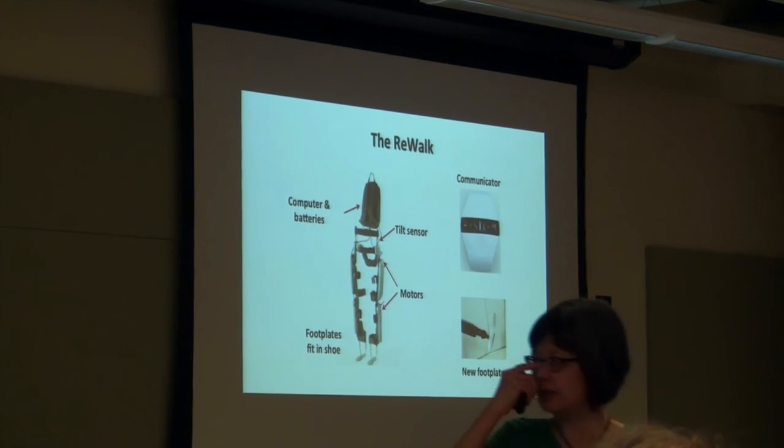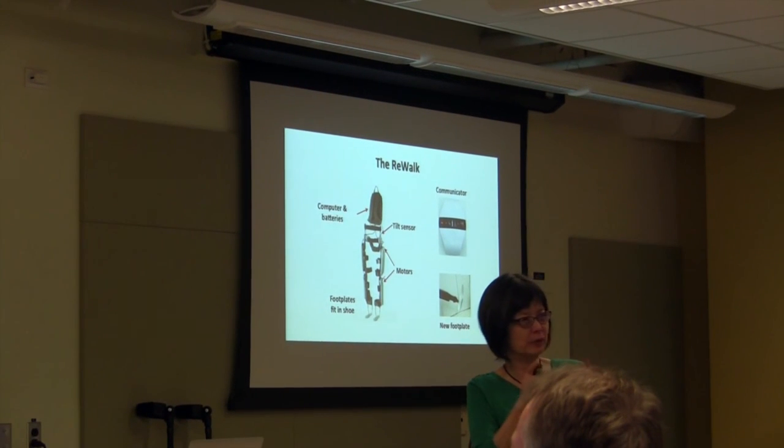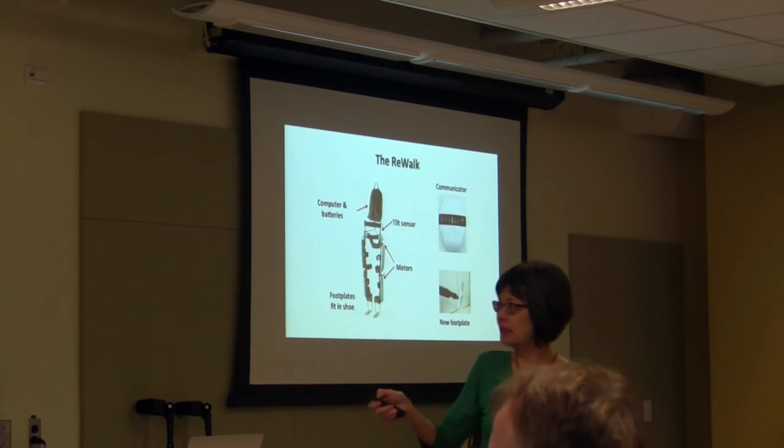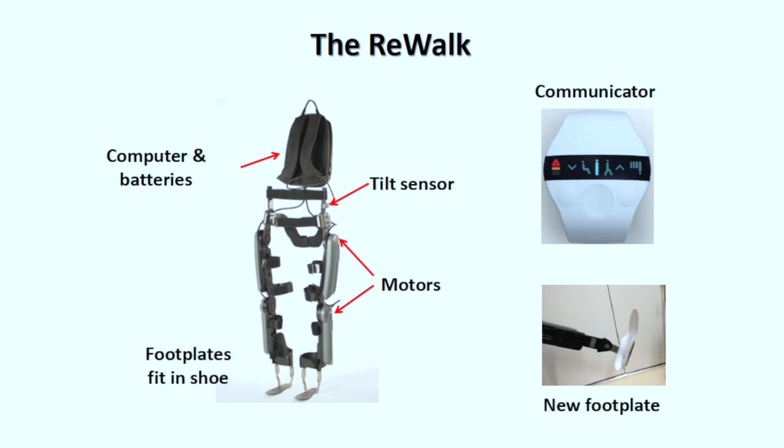To tell you a little bit about the device. The picture here is showing an older version of the device. If you look on the website now, it's slightly different. But this is the one we have. It has motors at the hip and the knee that move the joints in the walking motion. And there's a computer and batteries that you have to carry around in a backpack. That's about 5 pounds. Now they've changed the design a bit, and I think have made it a little smaller and modular, and it's actually on a fanny pack kind of thing. You have to wear a wristwatch-like device here, which I don't know if you can see very well, but that's where you select the mode.